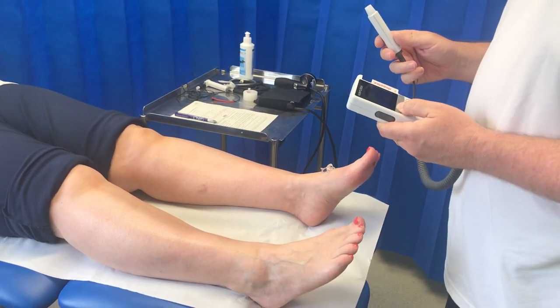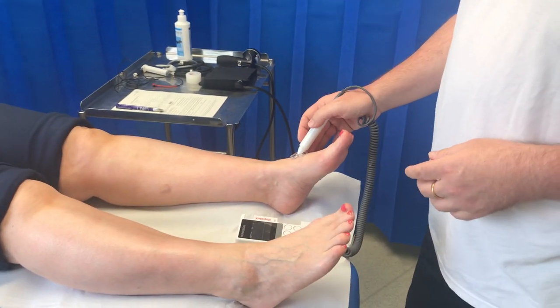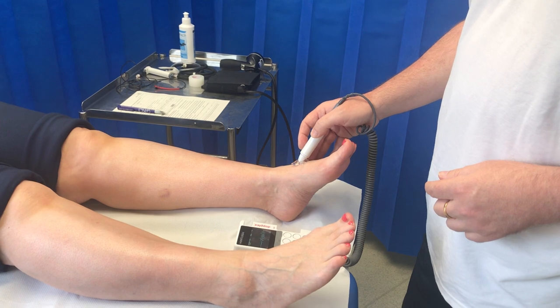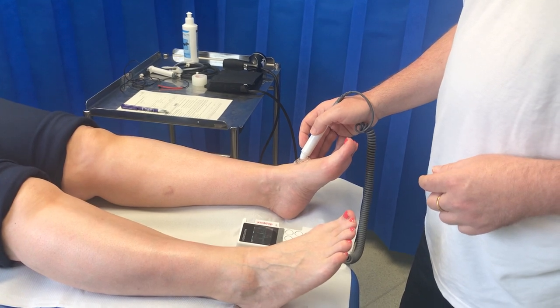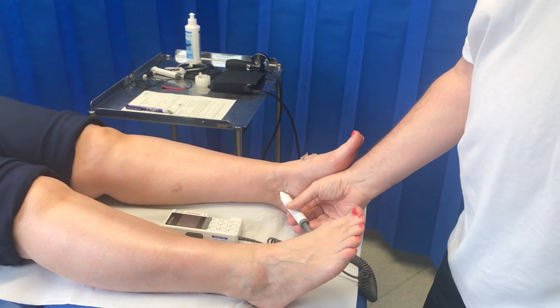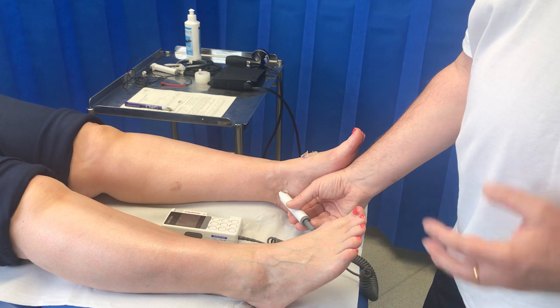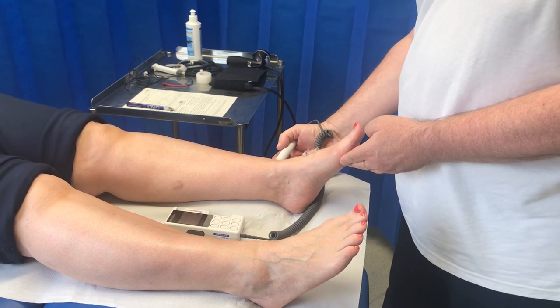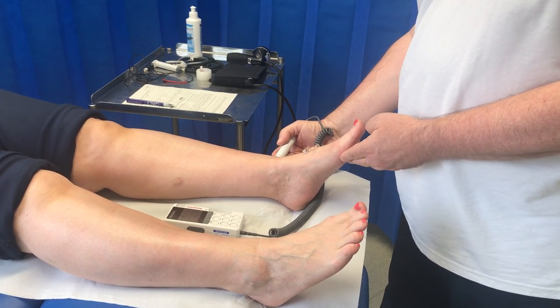I turn my Doppler on. I'm going to be anchored to the foot, angled at about 45 degrees, and for the dorsalis pedis pulse I'll be searching by sweeping slowly across the top of the foot. In this case we have a multiphasic pulse. I'll now move to the posterior tibial pulse behind the malleolus — again anchoring my hand to the patient's foot, sliding the probe around to locate the pulse. I will then search for the peroneal pulse on the outside of the foot, above the lateral malleolus, to see if it's audible, which in a critical limb ischemia patient it may not be. We have an audible peroneal pulse there.